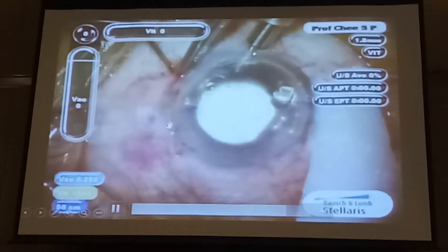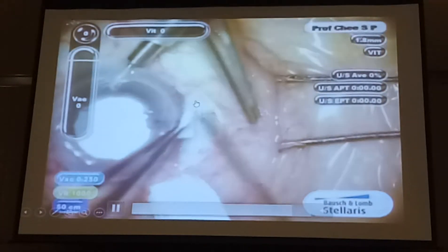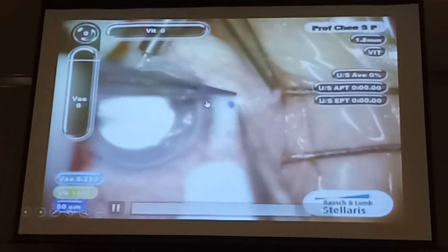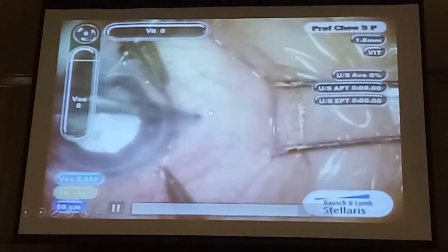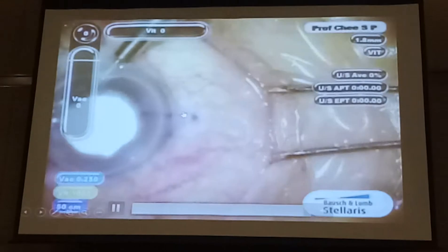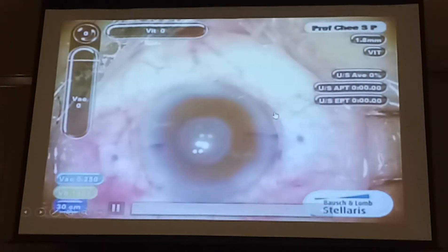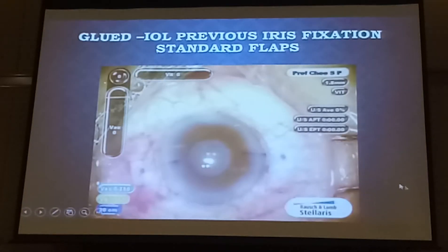This is just using glue to glue back the flaps. This makes surgery easy; it gives it a very catchy name of a 'glue lens,' but certainly it's not helped by the glue — it's helped by its intrascleral position in a snug tunnel. The air is just to make sure that the wounds are dry, and then you remove the air, and then you have a perfectly centered lens.